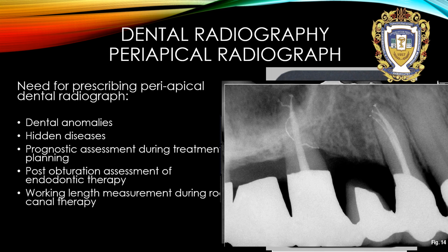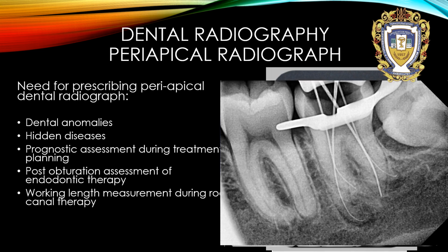Working length measurement during root canal therapy. As you can see, the doctor put files into every root canal and made an X-ray with those files, and the length of every file must be measured and noted for future steps of endodontic treatment.